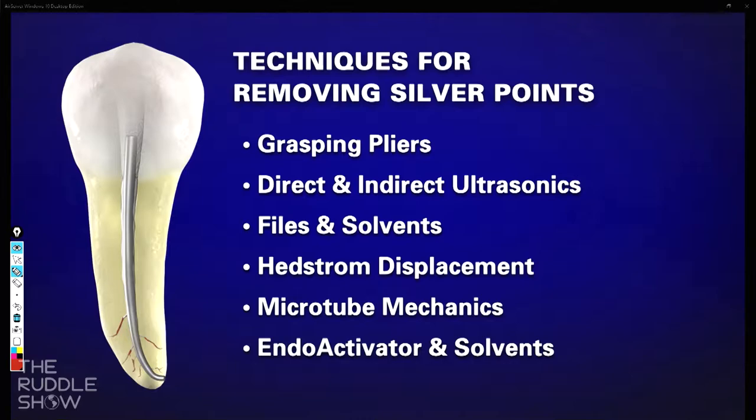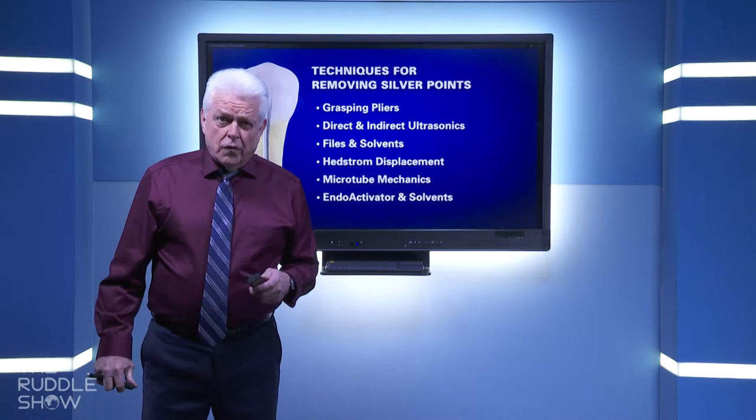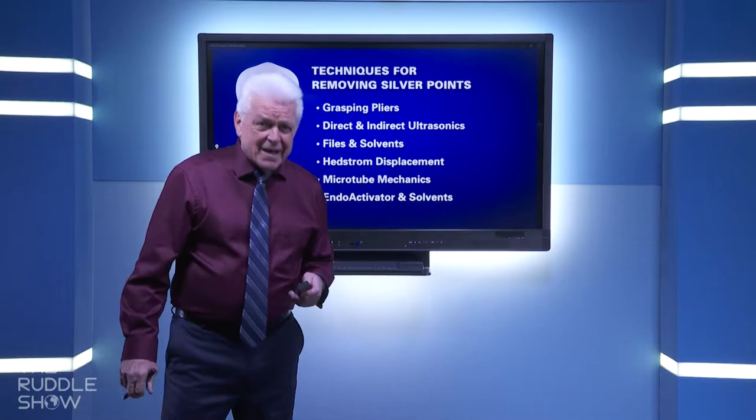The techniques that have emerged are quite a few, and we're going to go through all of these. The list seems maybe a little formidable right now, but just get the list kind of in your head, and then we'll give examples and work our way through it. This is not the complete list. In fact, when I used to teach this class to people who traveled in from around the world to Santa Barbara, we gave a two-day course, 10 hours each day. We were on silver points for 2 hours. Today, I'm on it for 30 minutes.